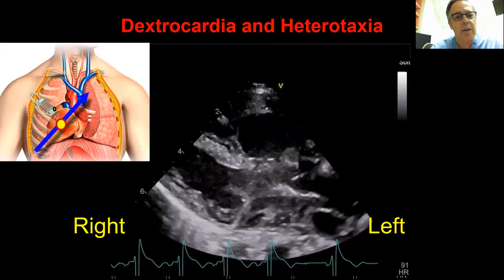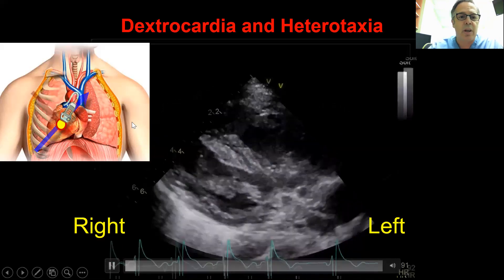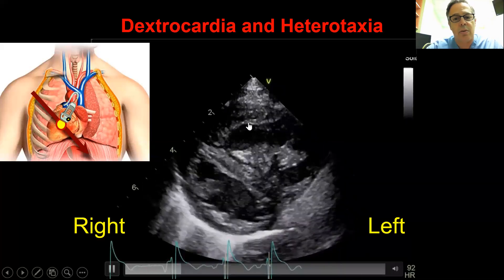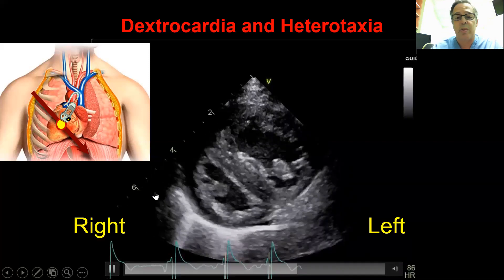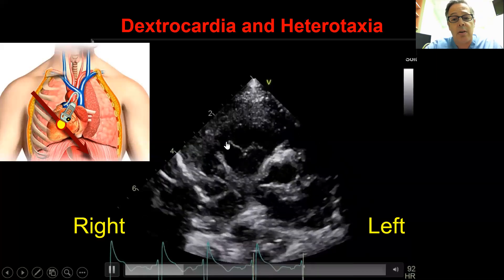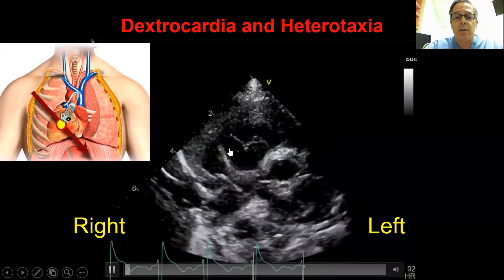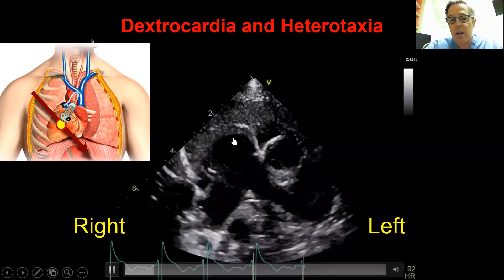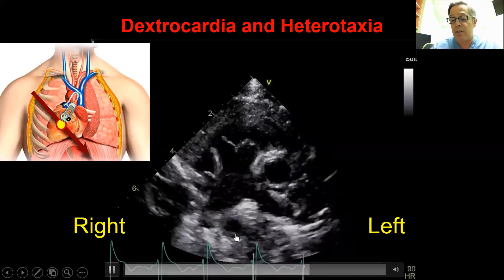The parasternal long axis view is obtained from the right parasternal position with the marker pointed toward the left shoulder. The parasternal short axis is obtained by rotating clockwise, with the marker pointed toward four o'clock — this again shows ventricular inversion with the RV on the left and LV on the right. Sweeping up to the base of the heart, you have an inverted vessel arrangement: the aorta is here with the SVC visible, and the PA branches are to the right of the aorta — inverted from what we typically see in a normal arrangement.